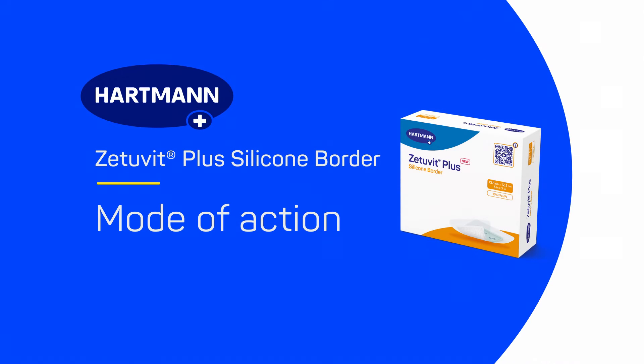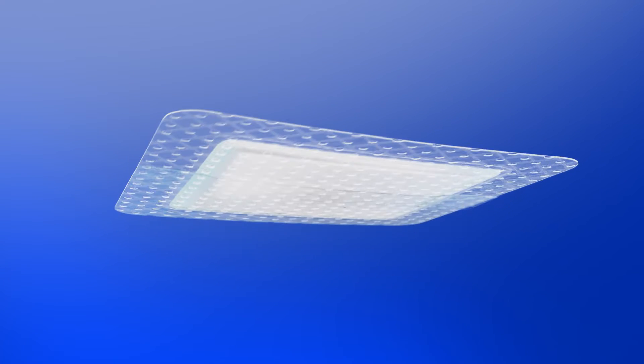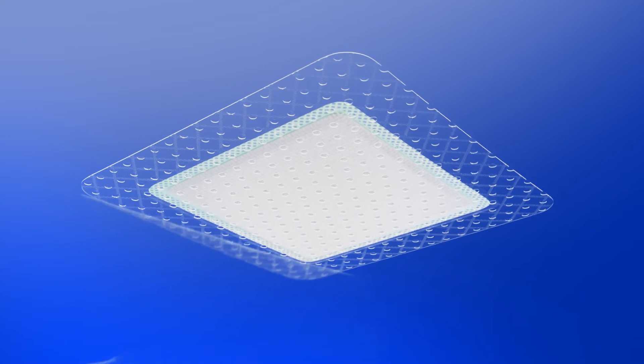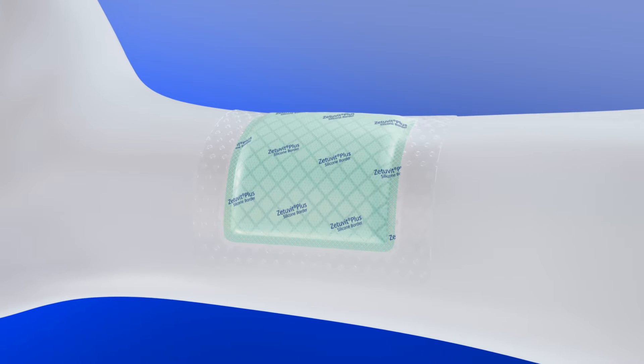Zetubit Plus Silicon Border – Mode of Action. Zetubit Plus Silicon Border is a versatile, self-adhesive silicone SAP dressing for use on a wide range of chronic and acute wounds with moderate to high levels of exudate. It is available in a variety of sizes and shapes and conforms to different body contours.